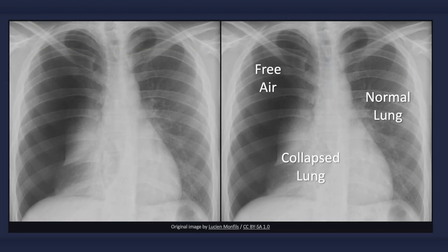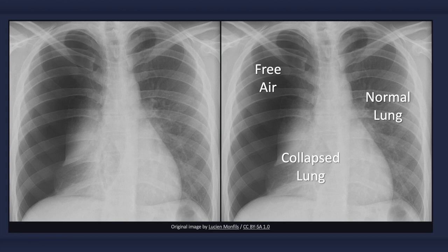Here is a more obvious X-ray of a pneumothorax. No lung markings are visible beyond the border of the right lung, which has collapsed. Notice the increased opacity of the collapsed right lung in comparison to the normal left lung. The right heart border cannot be identified because the collapsed lung is indistinguishable from the heart — this is referred to as the silhouette sign. The trachea is central as mediastinal shift does not occur.